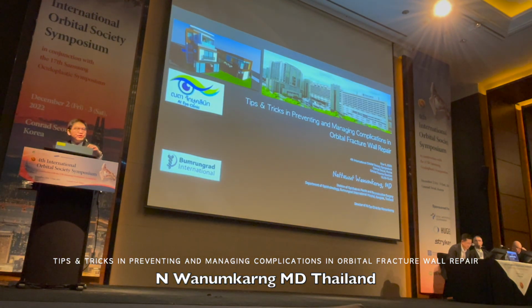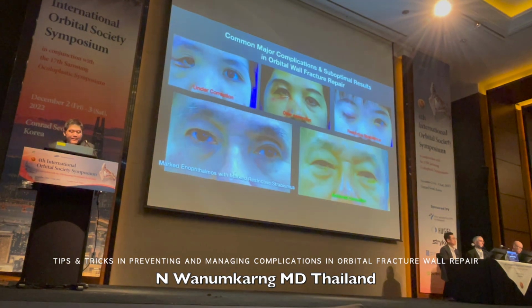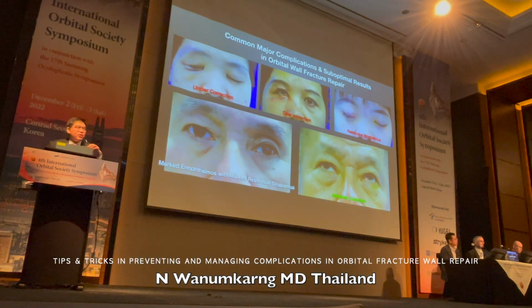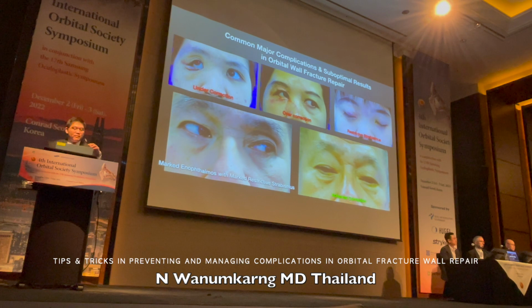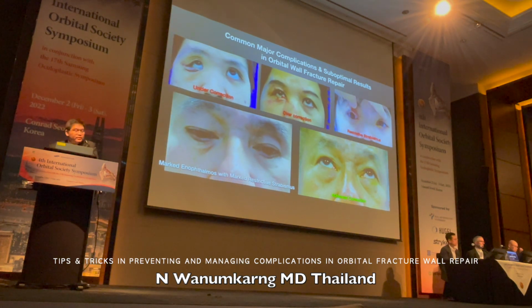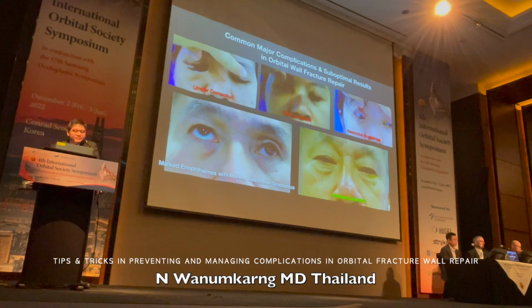Today, I would like to share some tricks that I use in my current practice. We know that the very common major complication or suboptimal result of orbital wall fracture repair is undercorrection or overcorrection or restrictive strabismus.